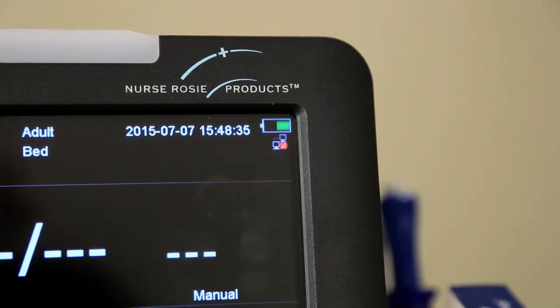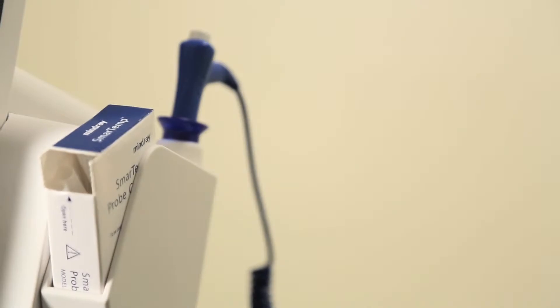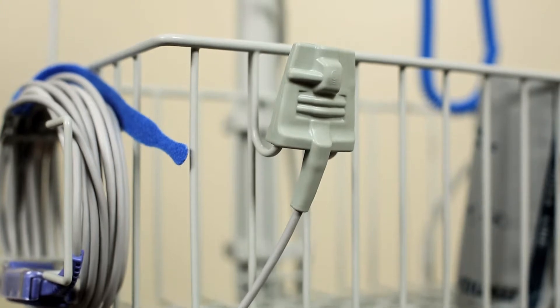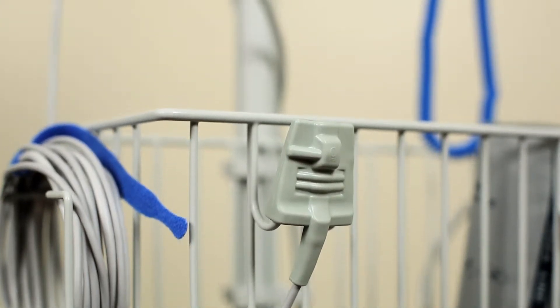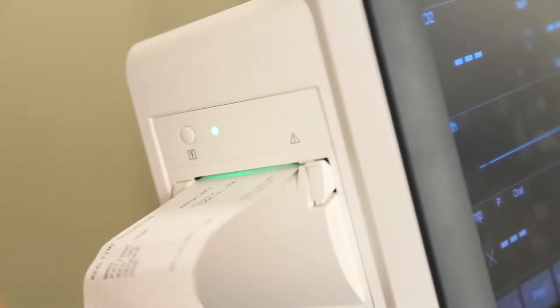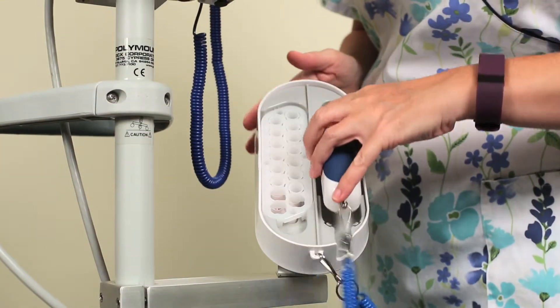Standard MUSE modified early warning score offers effective support for LT-PAC facilities. 8-hour lithium ion battery. Accessories and rechargeable battery are warranted for 90 days from date of purchase. Comes with a rugged rolling cart and basket, printer with time and date stamp, and a 3-year warranty with replacement loaner program. You can also add a Rosie SmartTemp tympanic thermometer to your Rosie 4.